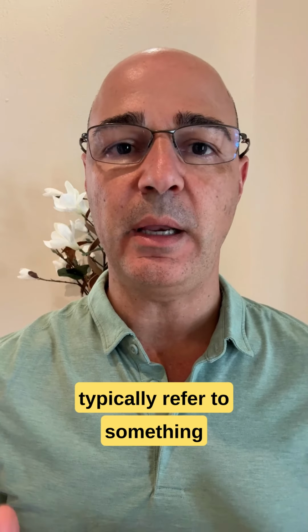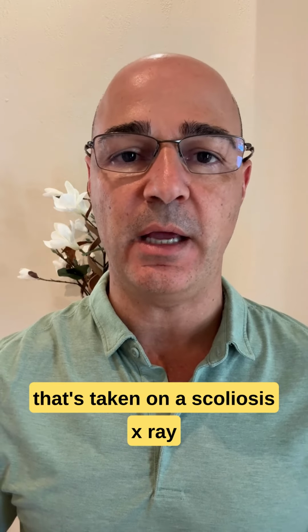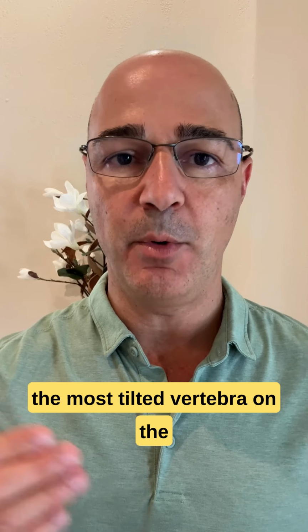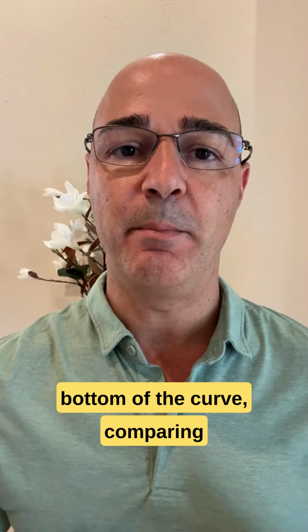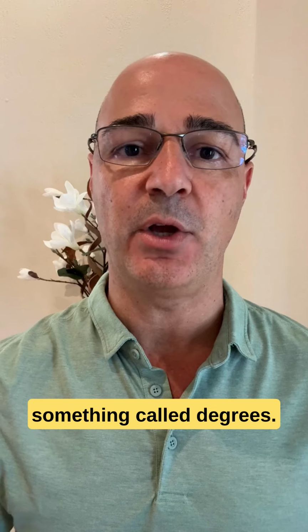Scoliosis measurements typically refer to something called a scoliosis Cobb angle. A Cobb angle is a measurement that's taken on a scoliosis x-ray, comparing the most tilted vertebra on the top of the curve to the most tilted vertebra on the bottom of the curve, comparing these two tilts and expressing the severity of the scoliosis in something called degrees.